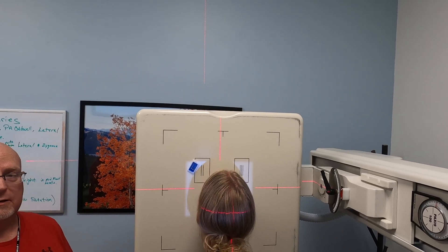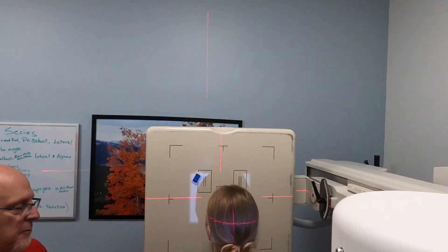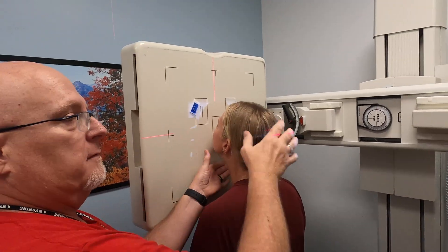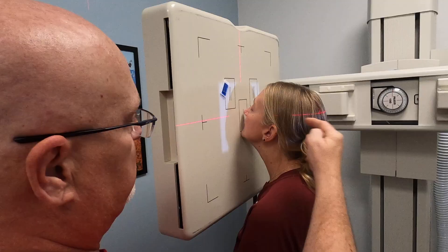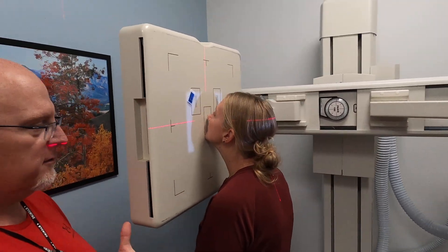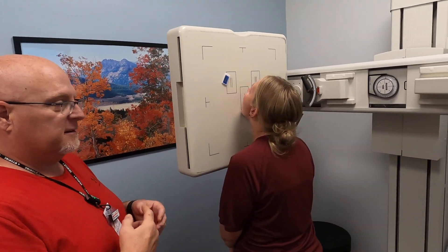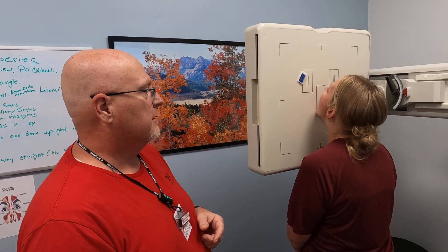Now we're going to do a modified Waters. We put the patient in the exact same position — nose just off the IR, chin touching. Same central ray at the acanthion. We're going to have Kate open her mouth and shoot this image with an open mouth. That's going to allow us to see the sphenoid and the ethmoid sinuses through the open mouth.